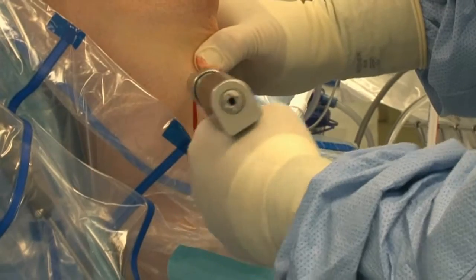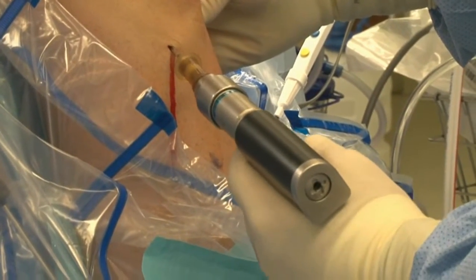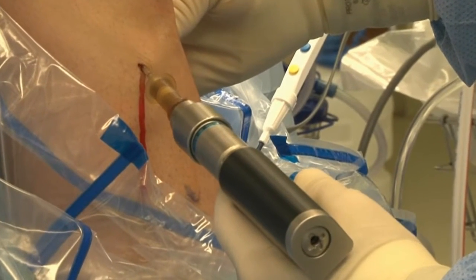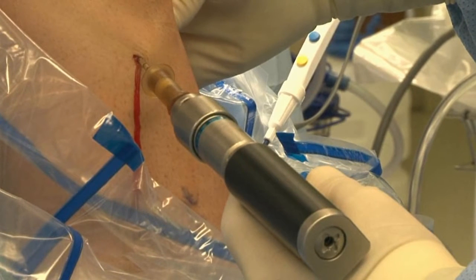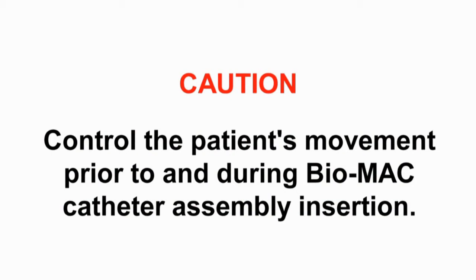Place the Biomac catheter assembly through the stab incision, abutting the trocar tip onto the cortical bone with a slight angle toward the fibular head. Then, utilizing a drill with a speed range of 1,000 to 3,000 RPM, activate the drill and apply gentle, steady pressure until the cortex is penetrated. Caution: control the patient's movement prior to and during Biomac catheter assembly insertion.